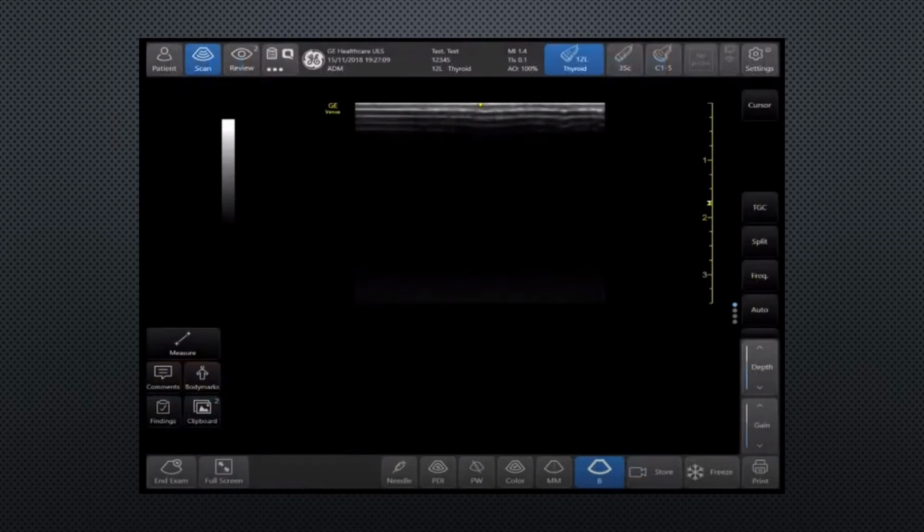So the depth controls on the venue are controlled in two different ways. There is this right here that you can either tap the up and down button, or you can tap the thing that says depth and move it up and down, or you can also grab this physical slider and move it up and down. And I'm using the words up and down intentionally rather than increase or decrease or go shallower or deeper because I think it makes more intuitive sense.